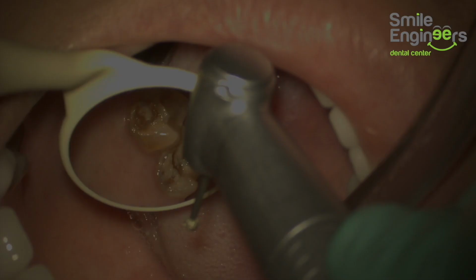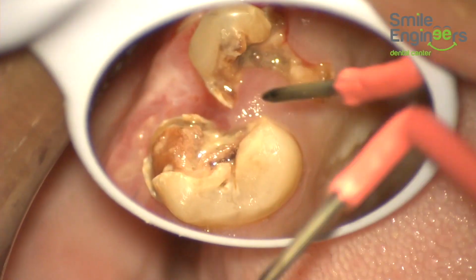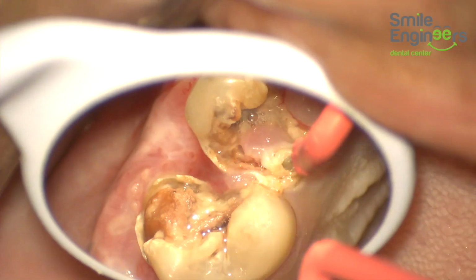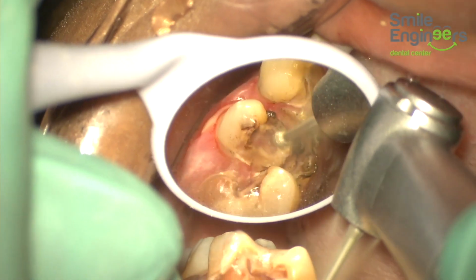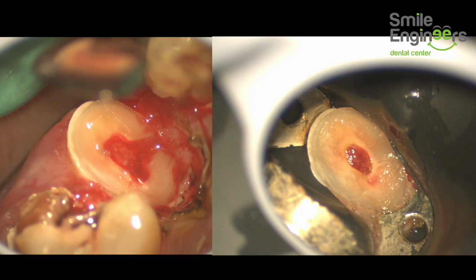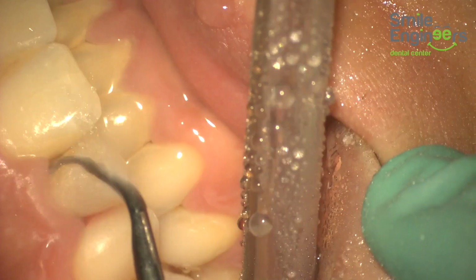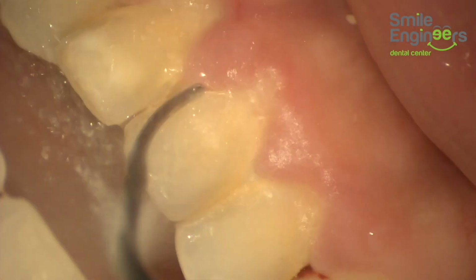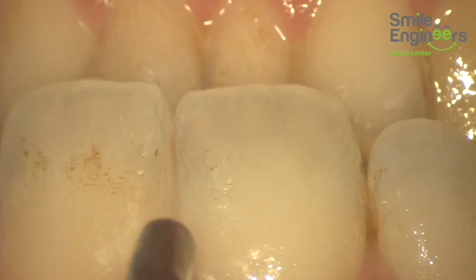Also, we can use the microscope for deep margin elevations and even for simple caries removal procedures. We can use it for crown lengthening or margin exposure or gingivectomy, for scaling and polishing, and for removal of stains with sandblasting.